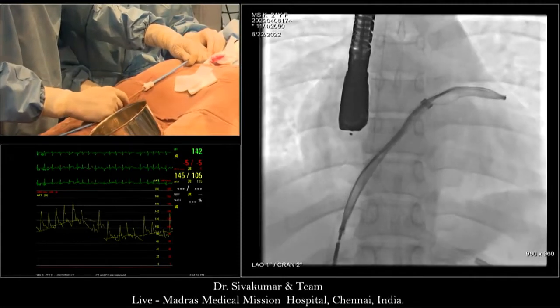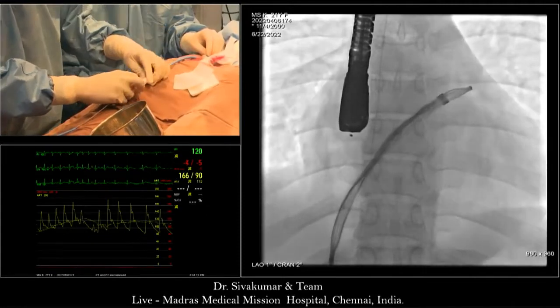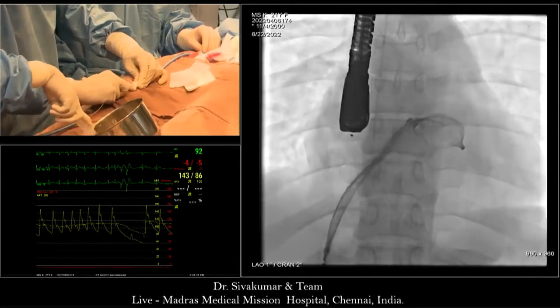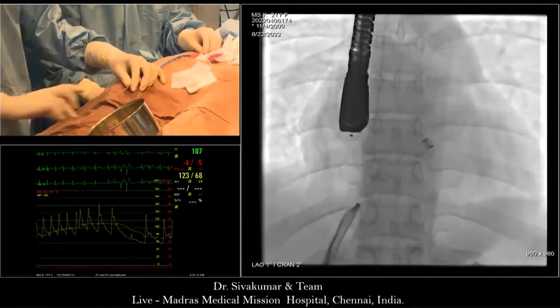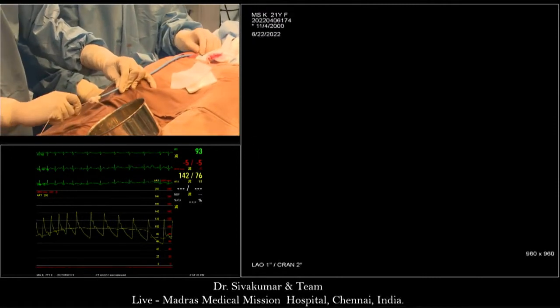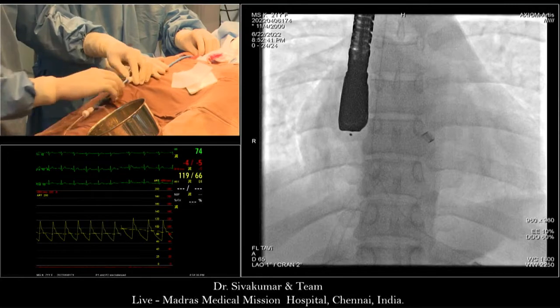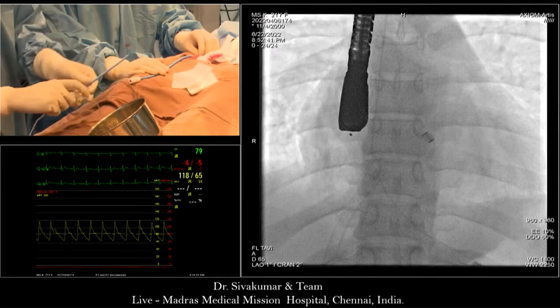I will recapture this one. He's deploying. So let's have a quick look at what's happening. Yeah, so that's what you were saying, Barak. It was a bit too deep. It wasn't releasing. But he's in the lower segment of the left pulmonary vein, not Cobra. Yeah, it's a Cobra. I will set it right. Actually, I should have chosen a left upper, but it was entering the left lower and I just accepted it. Sister, I want an RCA catheter.